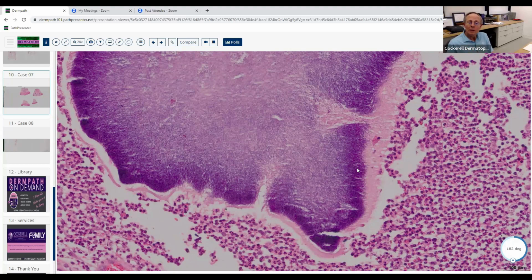And what bacteria cause botryomycosis? Usually staph, Pseudomonas. Yeah, it's gram-positive cocci. It's usually chronic staph, and it's usually an immunocompromised patient. Instead of the bacteria causing something like cellulitis or an abscess, they actually start forming colonies, and they get these little grains of gram-positive cocci that you can see. So if something's gram-positive, what is that going to look like when you stain it? Purple. Good.